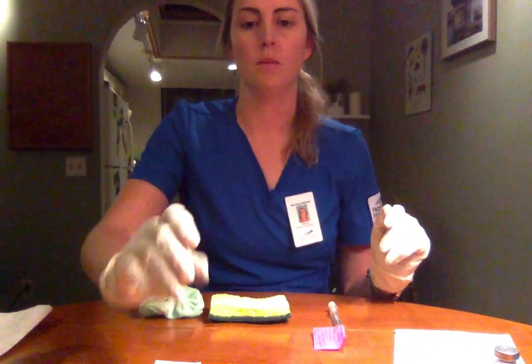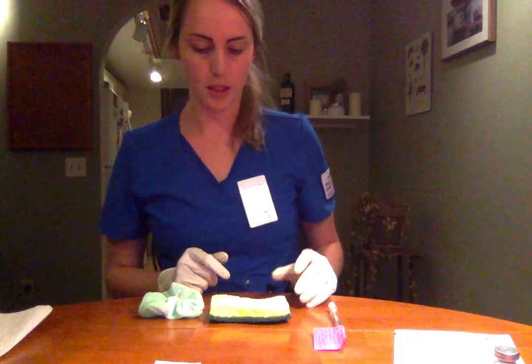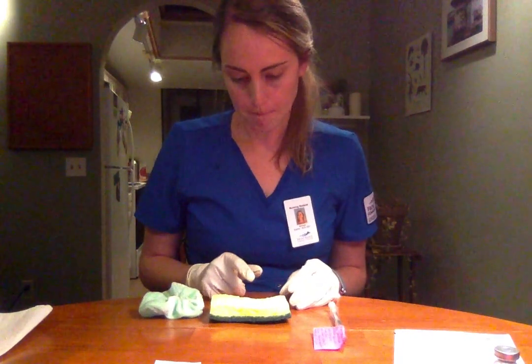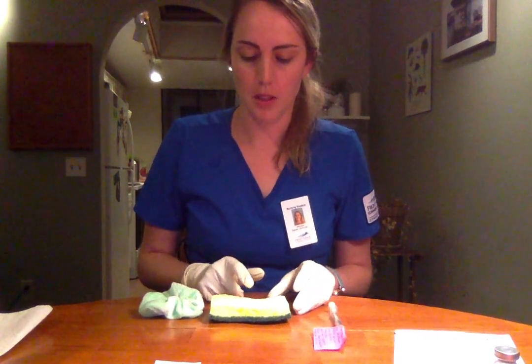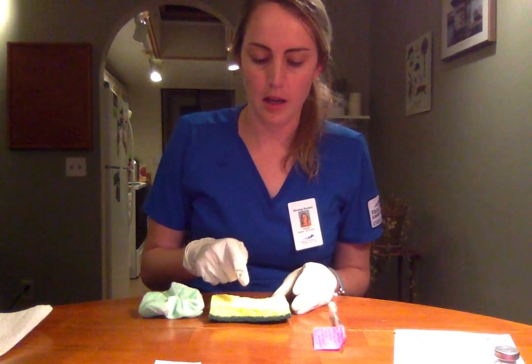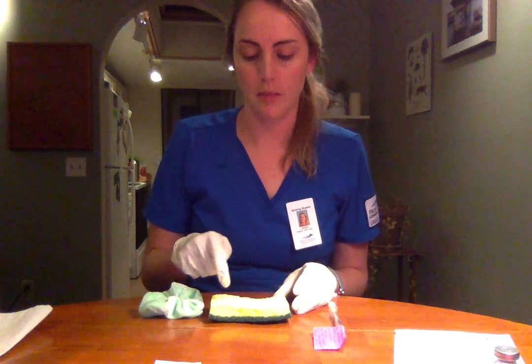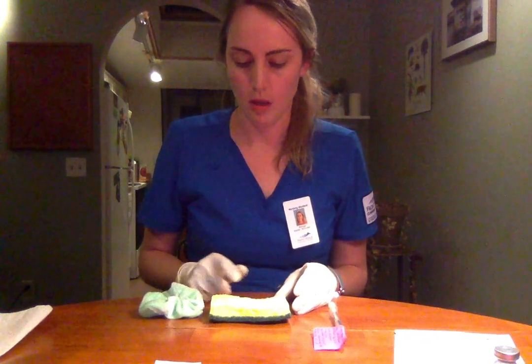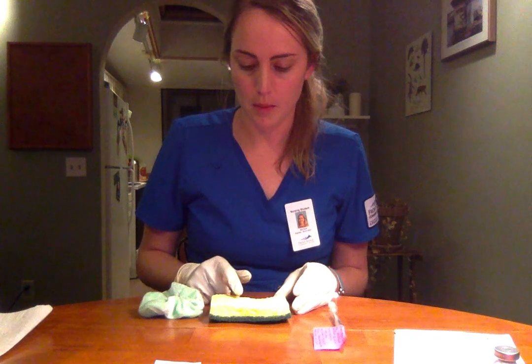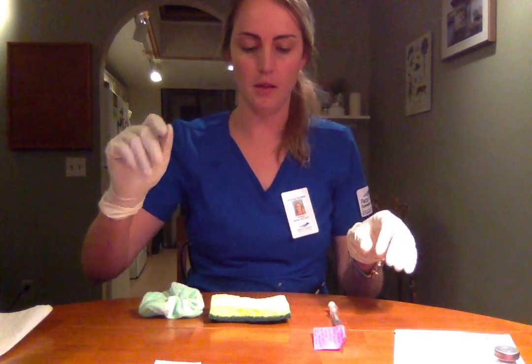So today I'm injecting, like I said, into the abdomen. And I'm going to make sure that I'm 2 inches away from the umbilicus and that I am not injecting at a site that has previously been injected into. Okay, so I have a site picked out and I'm going to go ahead and get my materials ready.